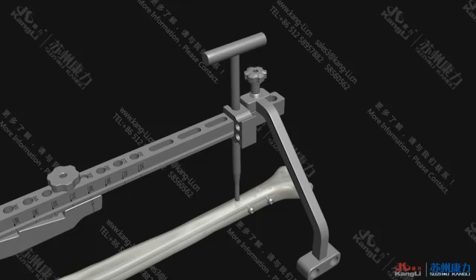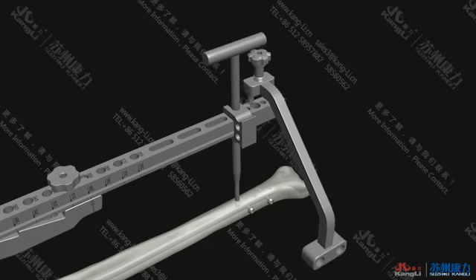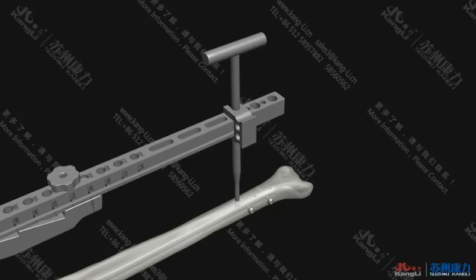The third and fourth 4.5 locking screws could be placed at the front or rear of the nail of the KTO Tibial Intramedullary nailing system according to the requirements of the type of fracture. The operation should be performed as follows.